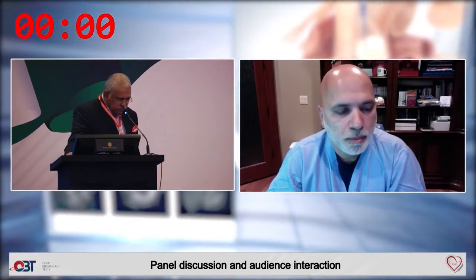In our program, I would say maybe about 2% of our patients are alternative access now, because with the availability of the peripheral shockwave balloon, peripheral arterial disease has become such an easy thing for us to fix. If the arteries are big enough and they're just diseased with calcium, using a shockwave pretreatment and then a transfemoral approach works beautifully. If that's not an option for any reason, then our preferred approach has been carotid. We haven't done a transaortic, apical, or subclavian in probably about 5-6 years now. Okay, thank you. As your program grows, it'll probably naturally evolve as well. Thank you.